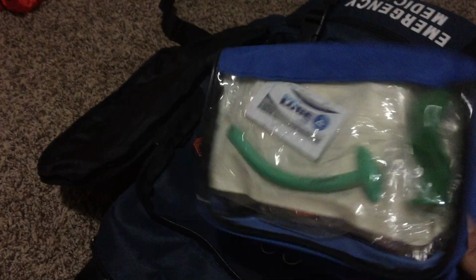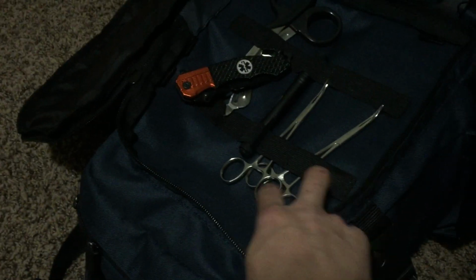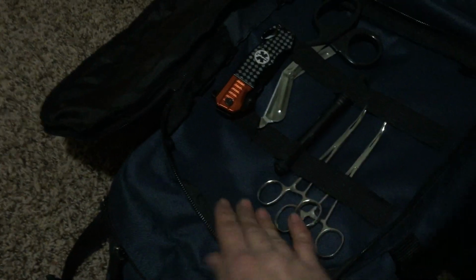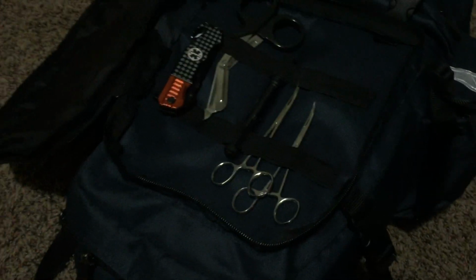So coming to your next pouch, I really like this one too. It opens up all the way and I've got my airway in there. So you've got all these little elastic straps in here. You can keep your hemostats and your flashlight. I've got a knife and some shears in there. You know, just easy access. I think I may end up putting my oral and my nasal airways in there, but right now I've just got them in a pouch in there.